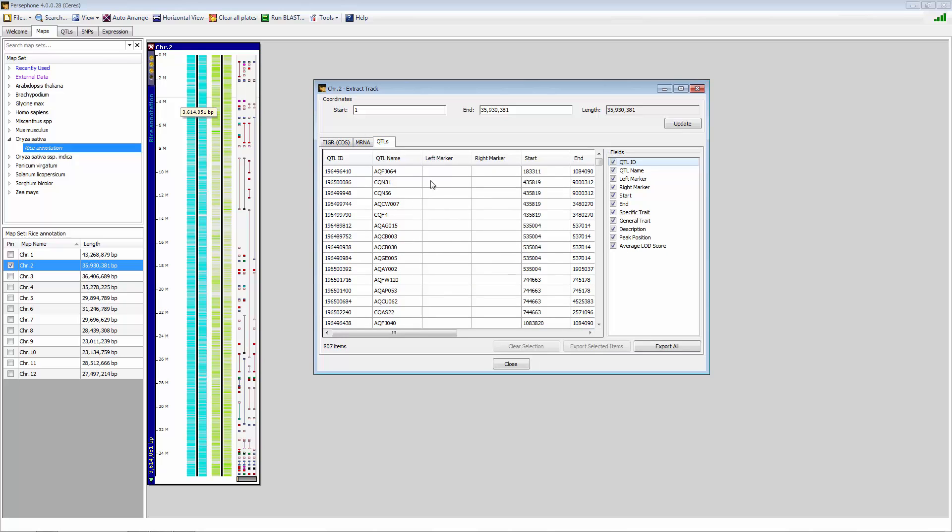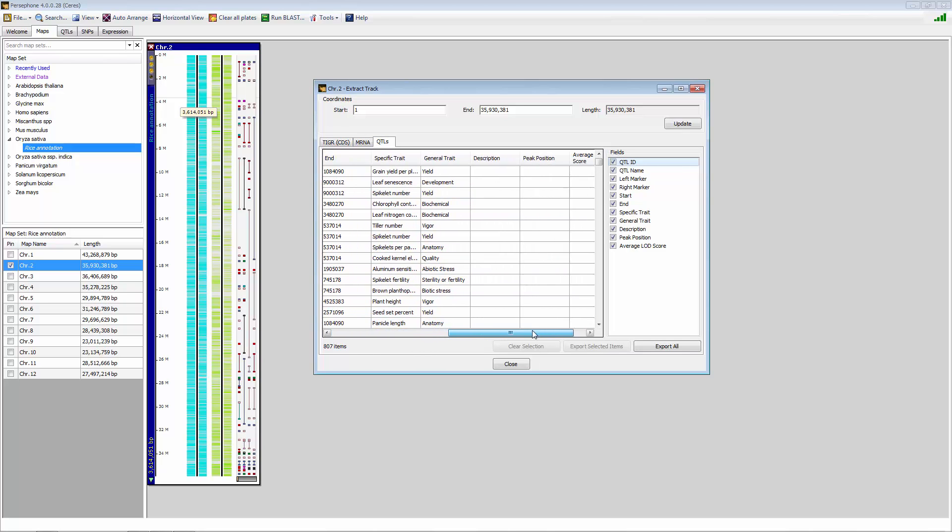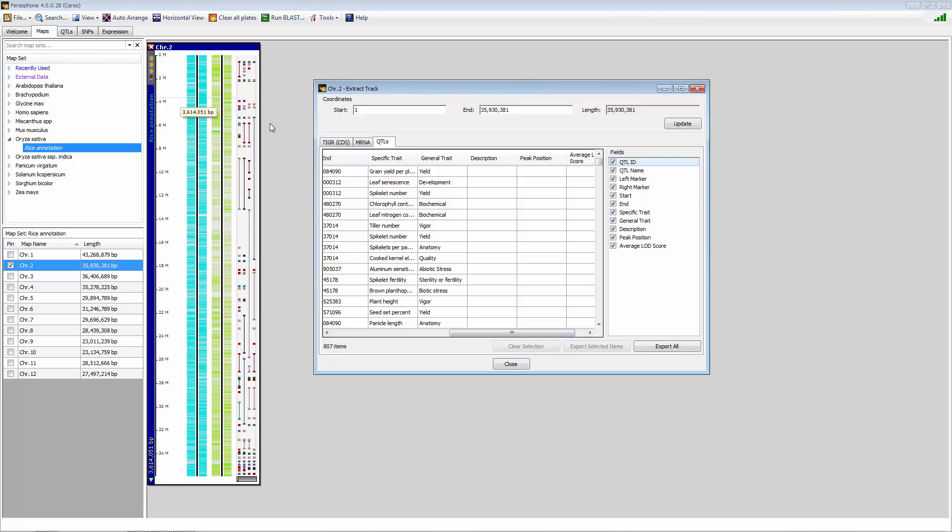And in RICE, we have a QTL track, so you get some added benefit of getting QTLs and certain traits associated with those QTLs if you're interested in that.